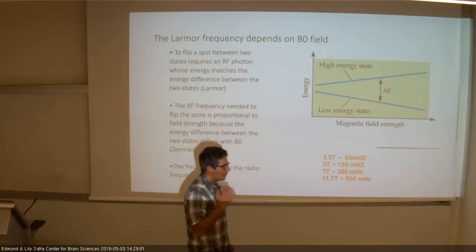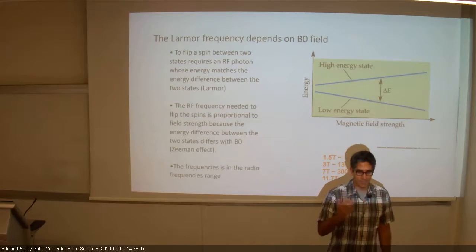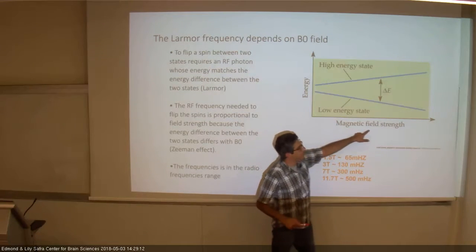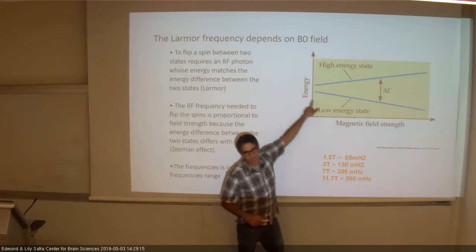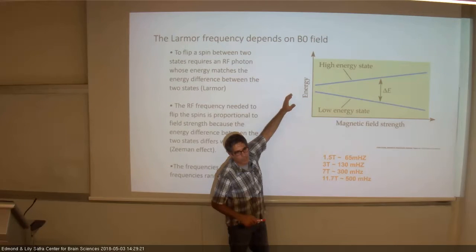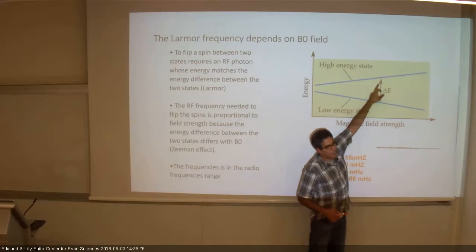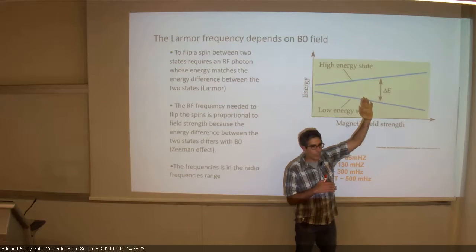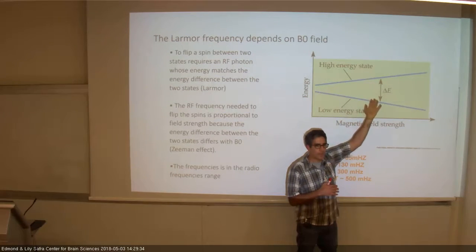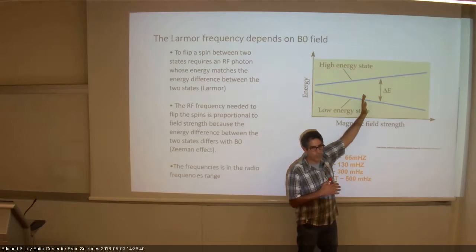moving around the main magnetic field, called precession, this phenomenon of precession, which has a frequency. And the level of energy changes according to the magnetic field that I'm using. So in Earth's magnetic field, it's kind of here. There is no difference between the two levels of energy, so that's why I have no signal. But as I increase the magnetic field, there is enough delta energy that they actually prefer one orientation, and I can also add energy, make them jump to one level versus the other, and then they will go back. Okay, so we have a way to perturb the system.